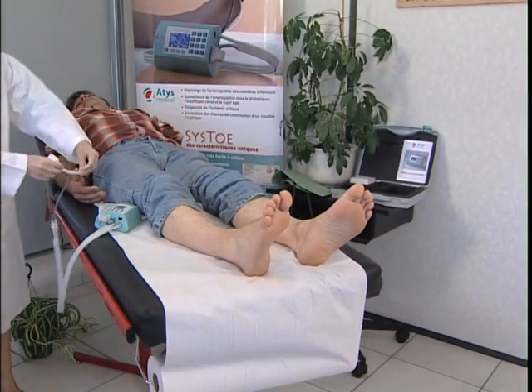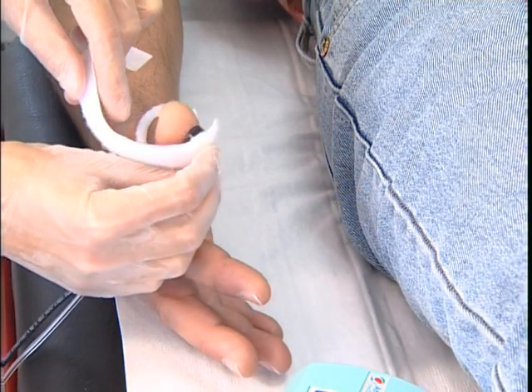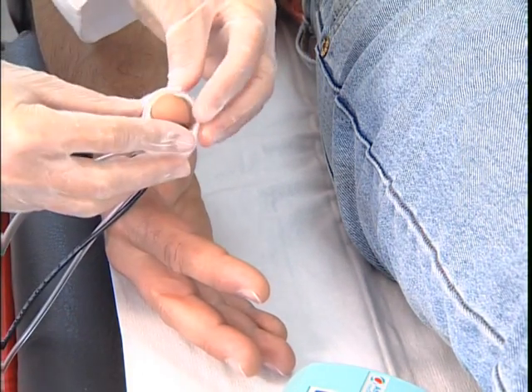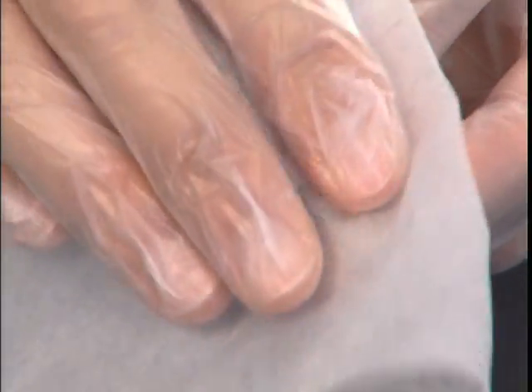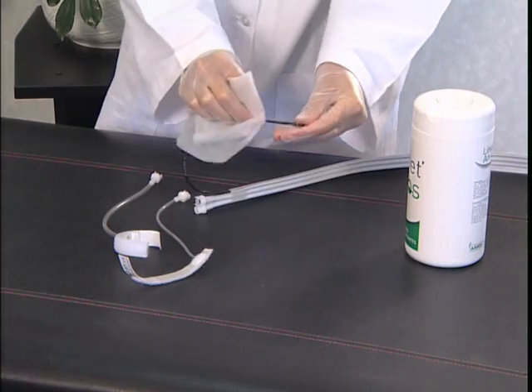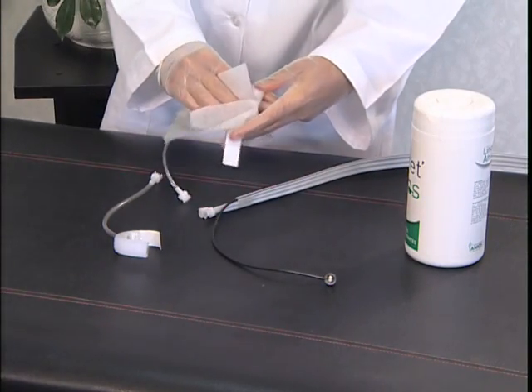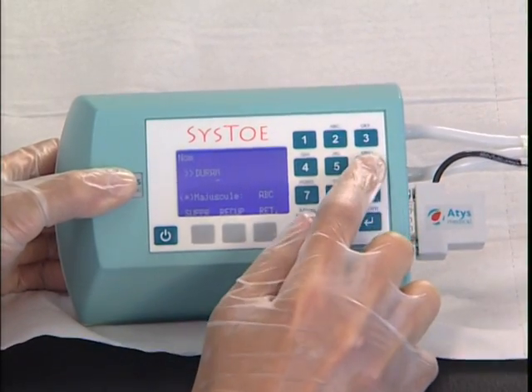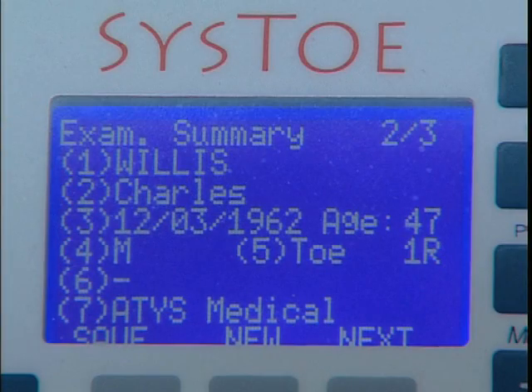The Cysto can also be used to measure systolic blood pressure in the fingers. After the procedure, the cuffs and the sensor are wiped clean. The Cysto can store results in its internal memory and details about the patient and the toe can be input using the alphanumeric keypad.